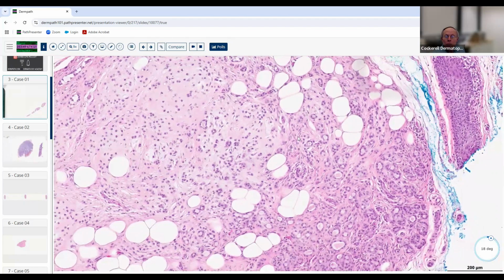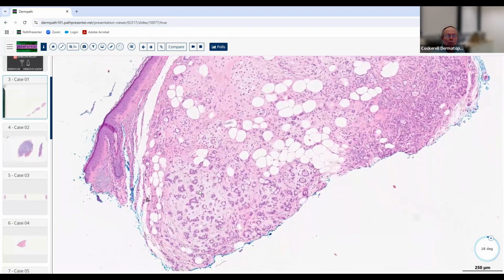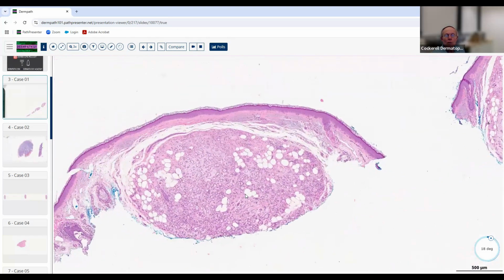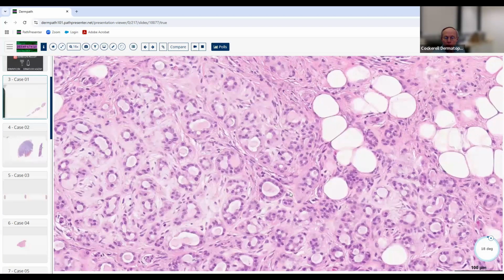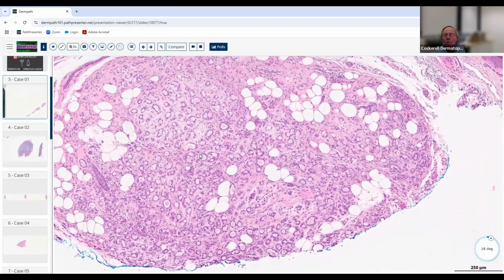And so we've got mucin, we've got ductal differentiation, we've got a small lesion that's very well circumscribed, totally benign in its appearance. It's a nice example of a mixed tumor of the skin, also known as a chondroid syringoma. Now, why do we call it a chondroid syringoma? Well, if you just look at a regular syringoma, they contain these little small ductal elements like we see here. And then the mucin in the stroma can undergo cartilaginous metaplasia. So we have fatty metaplasia, and then we can get cartilaginous metaplasia. In this case, we don't have any cartilaginous metaplasia, so probably it would be better to call this a mixed tumor rather than a chondroid syringoma. But those are really both analogous synonyms, if you will.